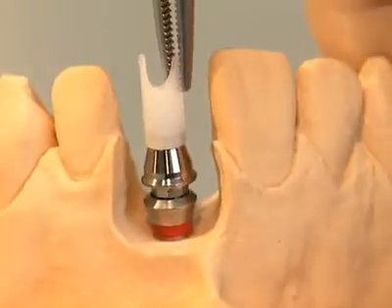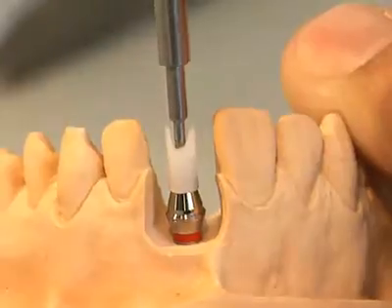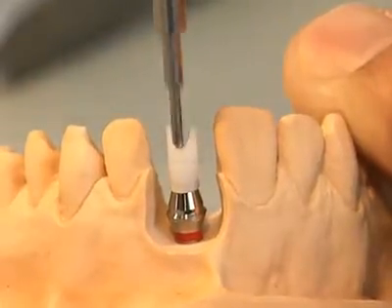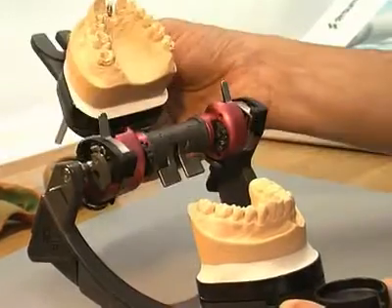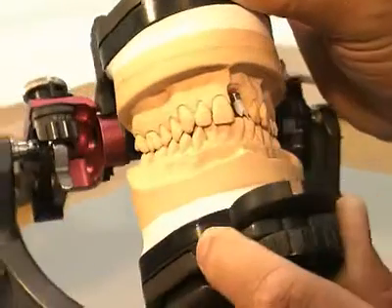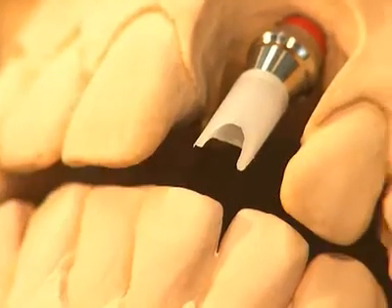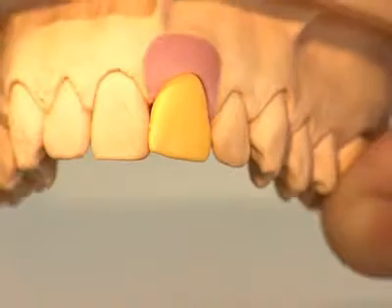It's important that the abutment is correctly positioned in the internal octagon before the internal screw is tightened. Depending on the individual circumstances, the modelling aid can be shortened to the previously marked height of the occlusal plane. For optimal aesthetic planning, a wax-up has to be modelled.